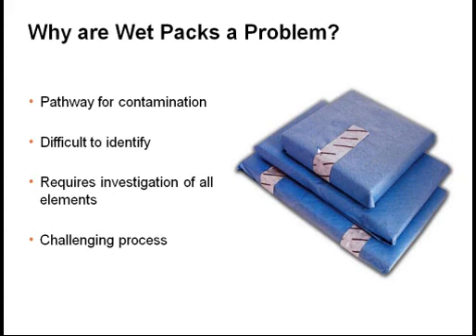Wet packs involve many players and factors, including steam quality, sterilizer loads, and the configuration of sets in loads. Since these issues do occur, staff members must complete the necessary documentation with process audits involving the sterile processing department as well as other departments, including the operating room. A simple format such as a wet pack log can be helpful. When detailed logs of wet pack problems are kept, the historical data pertaining to wet packs could provide valuable information for the current issue.